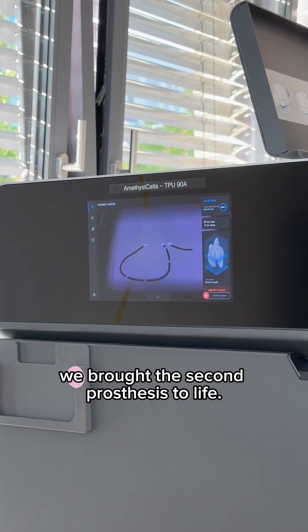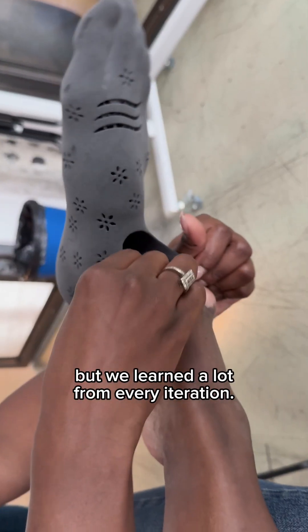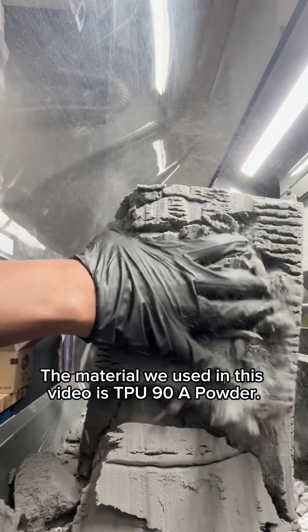Once the design was finalized, we brought the second prosthesis to life. Honestly, the first attempt was far from good, but we learned a lot from every iteration. The material we used in this video is TPU 90A powder.